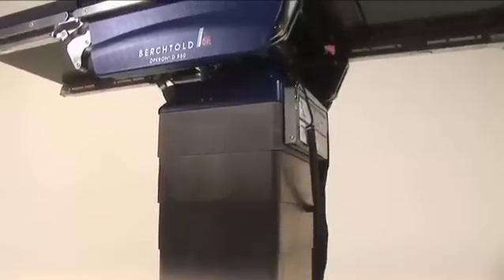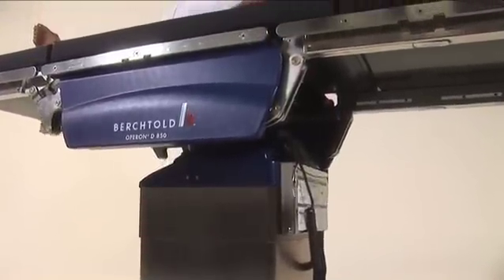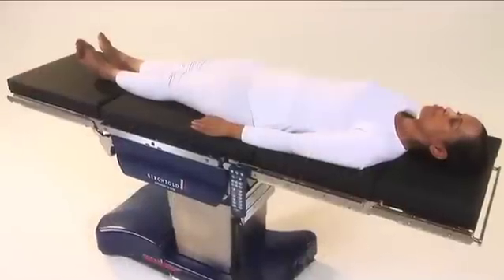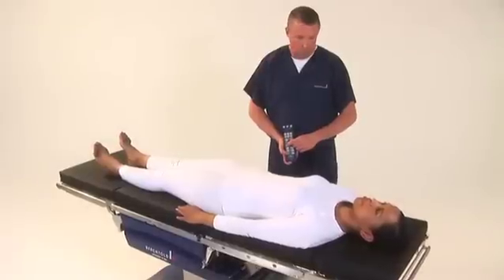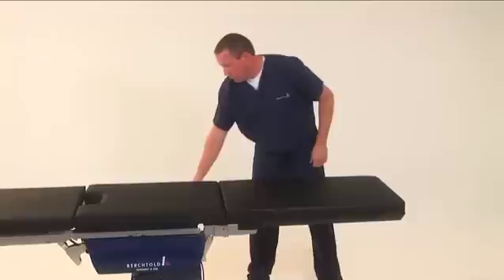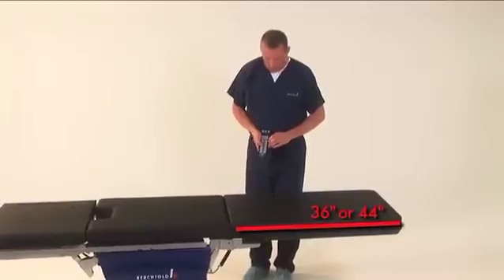The D850's unique base design and longitudinal slide ensures the table does not need to be reversed for upper body imaging. Note that reversing the table will drop the weight capacity to 500 pounds. For upper body imaging, use the hand pendant to slide the table toward the head. If additional imaging area is required, a 36-inch or 44-inch imaging extension is available.